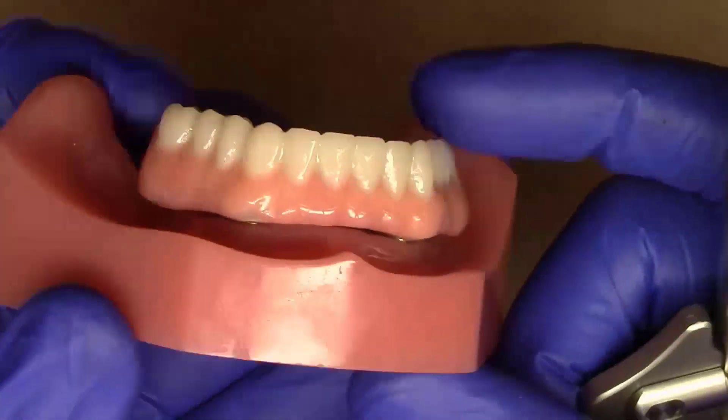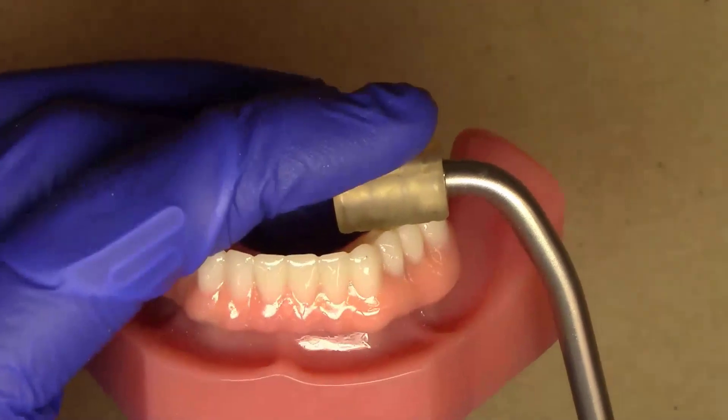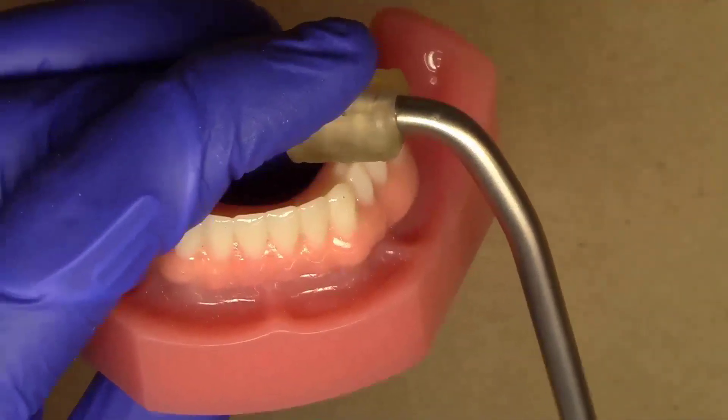And now you can see that I've got the prosthesis fully seated down all the way. Showing that little instrument up close, I'll hold it very lightly with my fingers and tap — one, two, three; one, two, three.